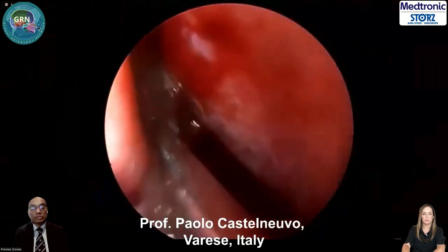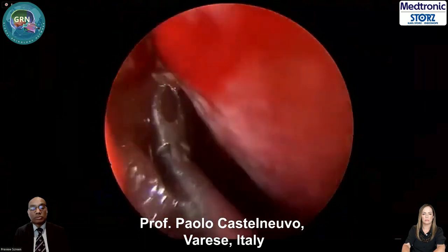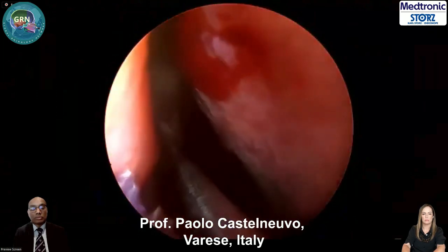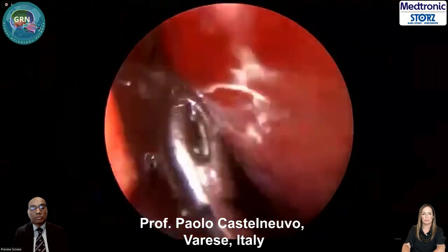I put some Oxycel here to promote granulation and closure in the second step.